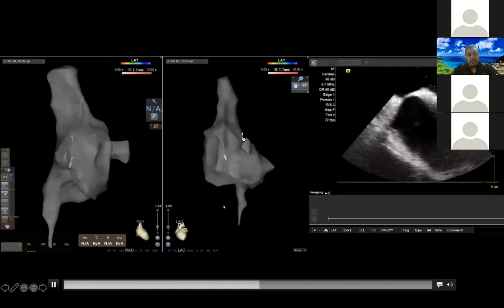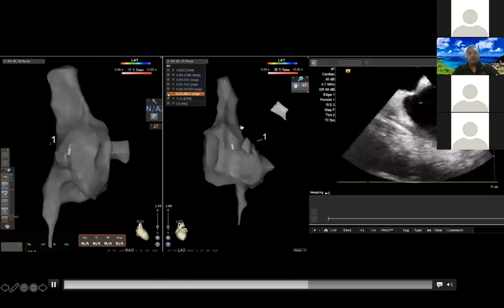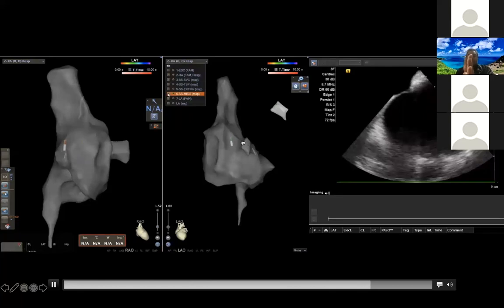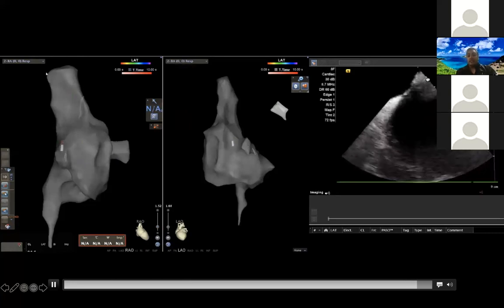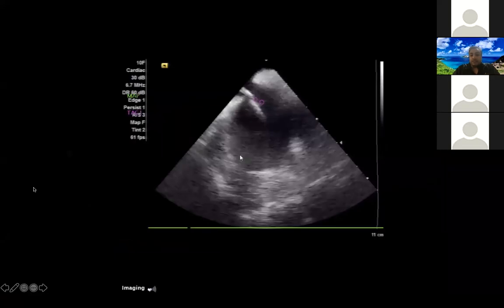But you can see this number 1, and oftentimes it will disappear. Yeah, it did disappear here. The reason it disappears sometimes is because you actually don't have matrix out here. So it's very common to come down, and as soon as you hit that zone where you're about to want to cross, the visualized tip will go away because there's no matrix. If that's the case, you really should be able to see it on ICE, right? So that's just another little nuance about this. But for the most part, I find this visualization to be very helpful.